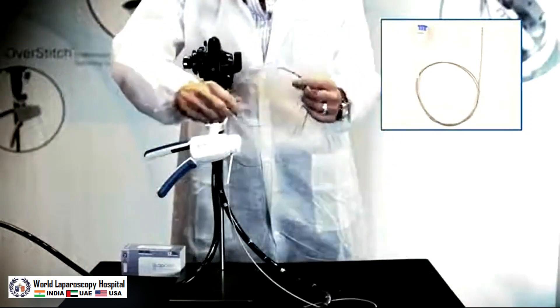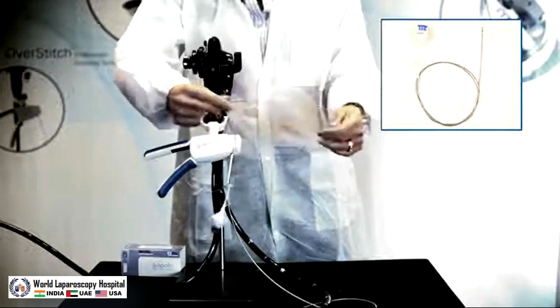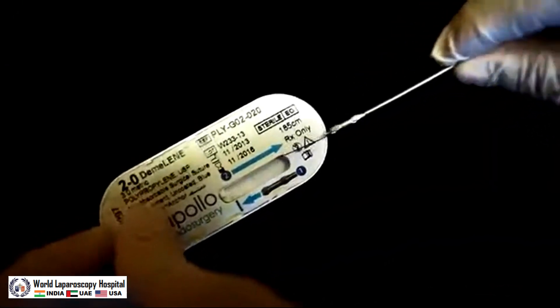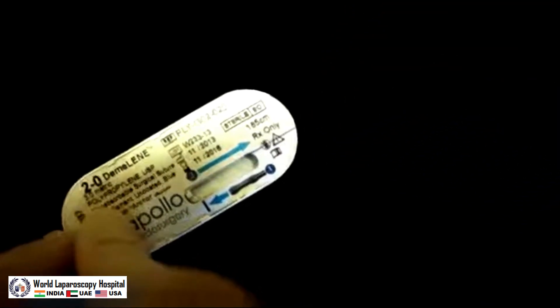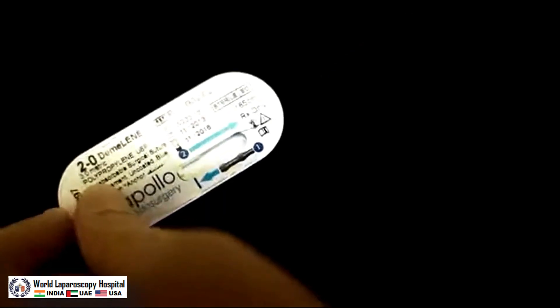Take the anchor exchange catheter that holds the anchor and the suture and load it with the anchor. The anchor will slide into the tip of the anchor exchange catheter. Once you feel it click into place, pull back on the suture and thread it through the therapeutic channel until the suture goes beyond the end of the tower, at which point you've created a suture loop and you can close the suturing handle.